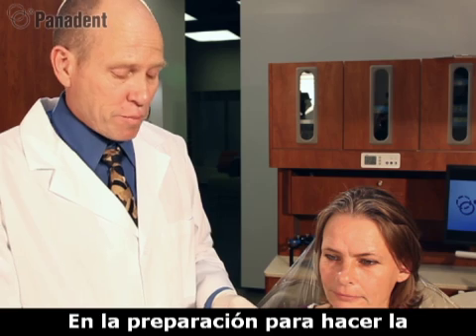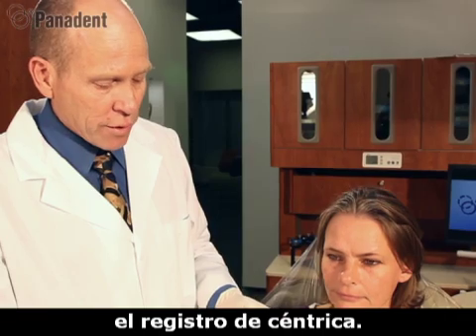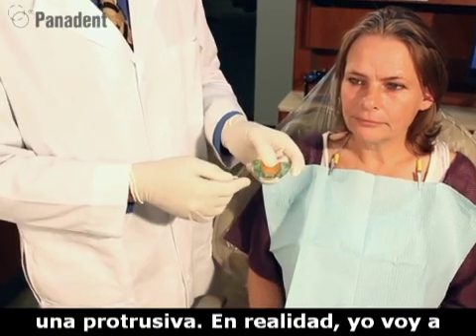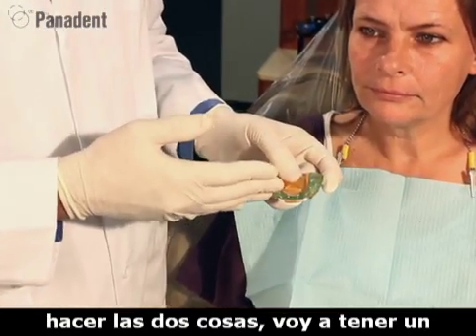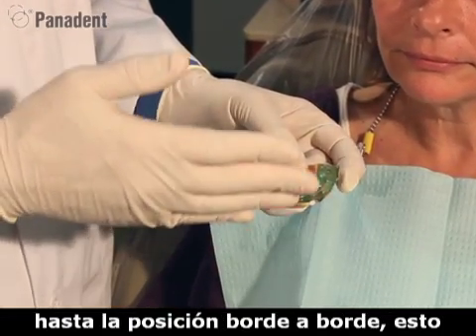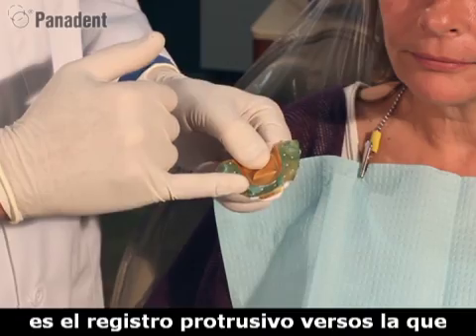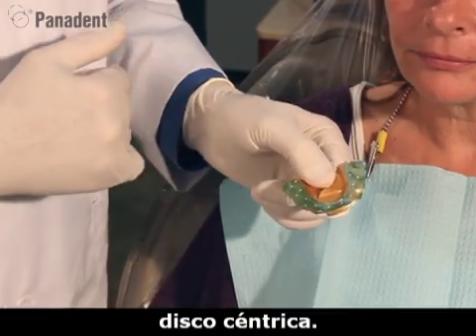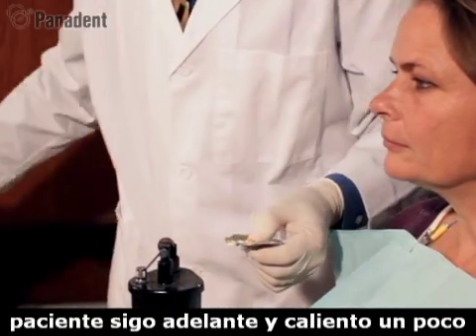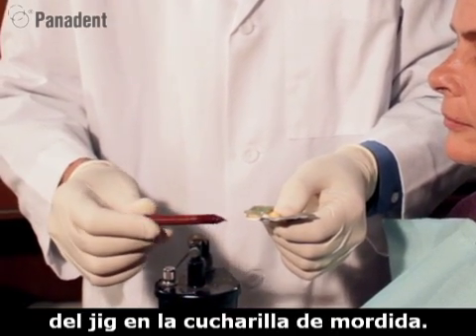In preparation for doing the protrusive check bite, the upper surface of the bite tray is exactly the same as the centric record. The only difference will be the lower compound jig index. Instead of a centric index, we're going to do a protrusive. Actually, I'm going to do both. I'm going to have her retrude and go into a centric index, and then open, come forward until it's edge to edge, and have her bite up until she's in edge to edge position. This will indicate that that particular tray is a protrusive record versus the one that only has one index, which is our centric record. So I'll go ahead and have the patient hold my torch here for me again while I heat up some more compound for an anterior compound jig on the bite tray.